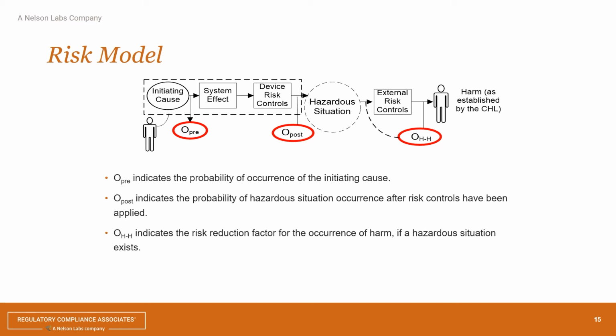And then once we ship our product out the door, the end users also mitigate issues to prevent a hazardous situation leading to a harm. That's completely outside of our system, but that's why you get clinicians involved to help you with the overall probability of occurrence of harm. When we talk about the severity, we're talking about severity of harm.